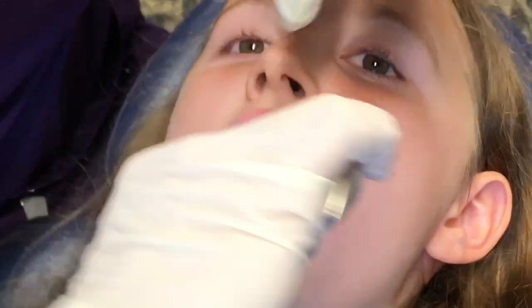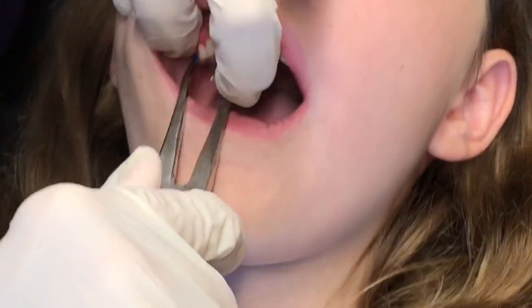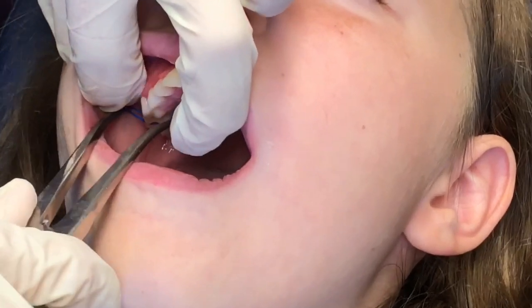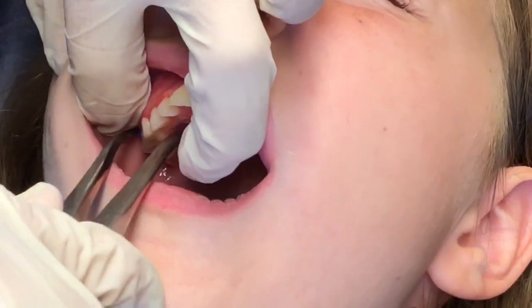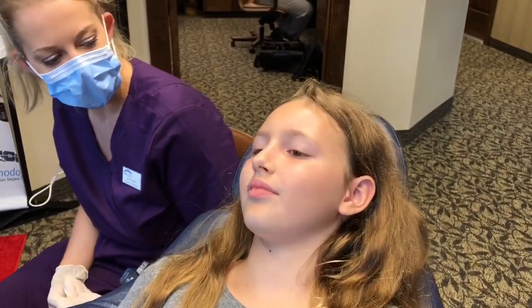So over the next week, mom, just make sure we're not flossing here. Try to leave it alone because it's going to loosen up over the next couple of days. If it does come out and it's like the day before, you can try to get it back in with just two pieces of floss — if you floss them in and pull it apart you can pop it back in. But usually they stay in pretty well. How's it feel? No gum or anything sticky, that'll pull it right out. We need them to make that space so we can start your treatment.